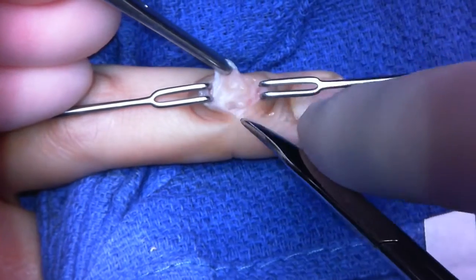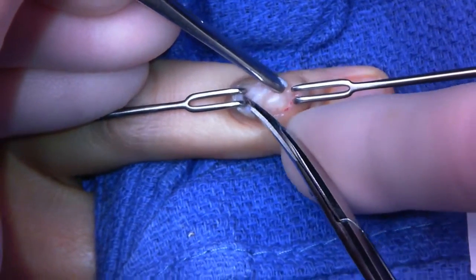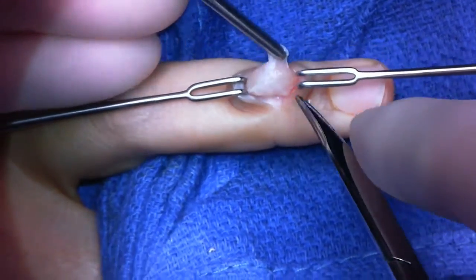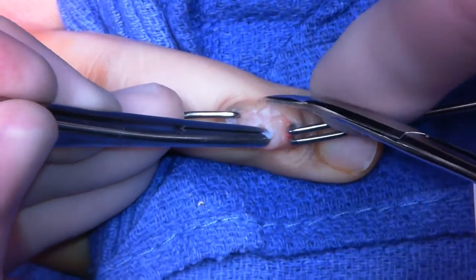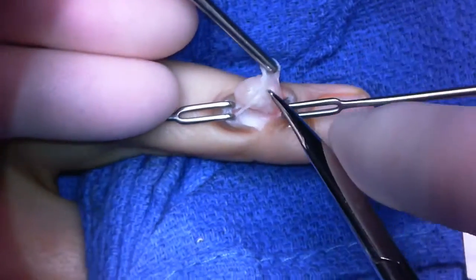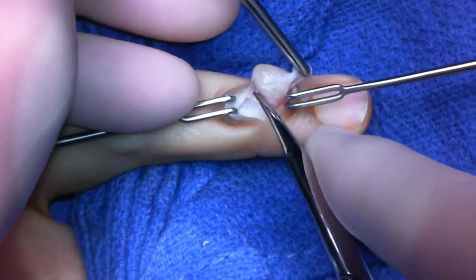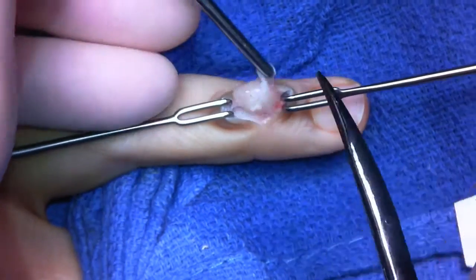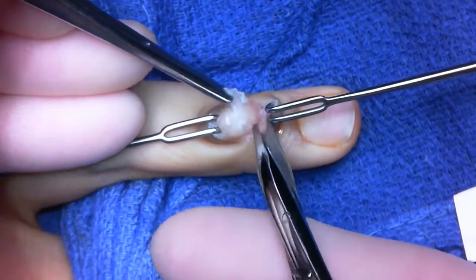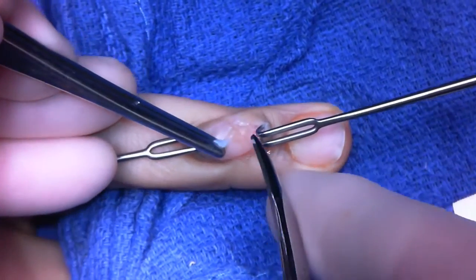I'm lifting this off of the Extensor Tendon. This shelled out nicely. Basically it had one extension going down into the distal interphalangeal joint.